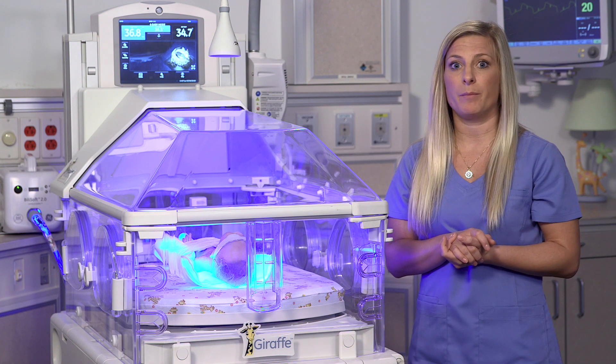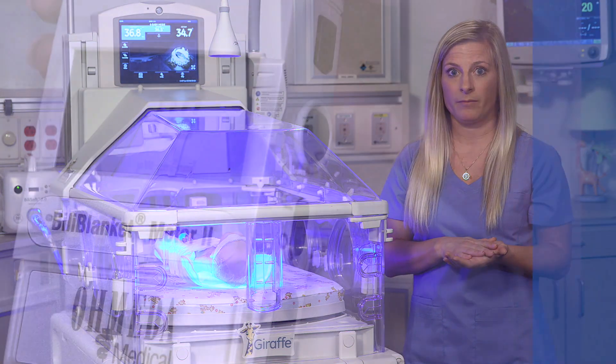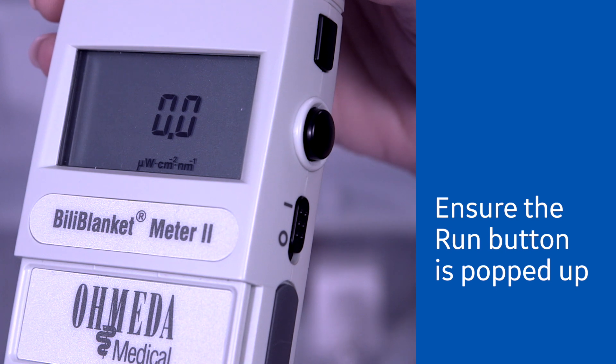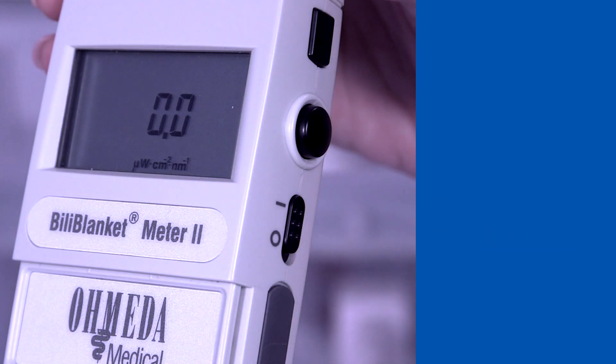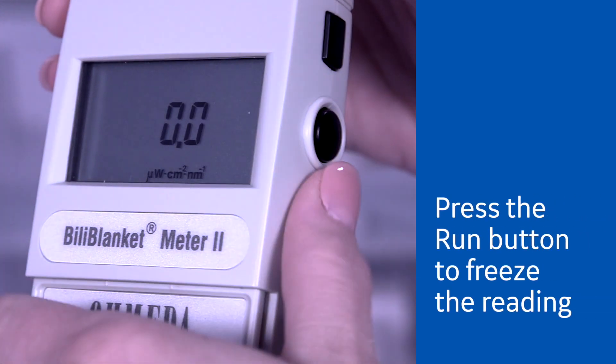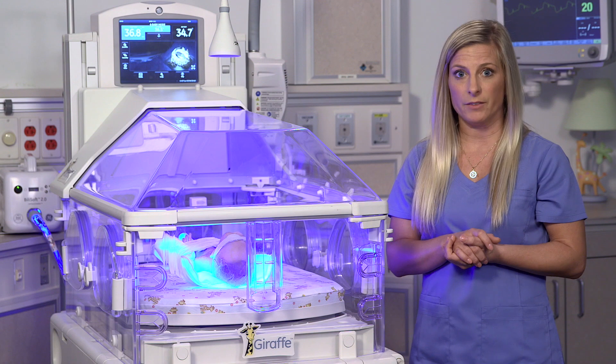To quickly measure the irradiance of the BillySoft, set the hold/run switch to the run position — it's this round button here. The BillyBlanket meter 2 now performs continuous irradiance measurements. To freeze the display and irradiance reading, press the hold/run switch push button to set it to its inward hold position. This freezes the display reading at the current spectral irradiance level.